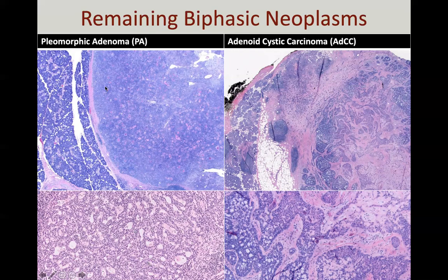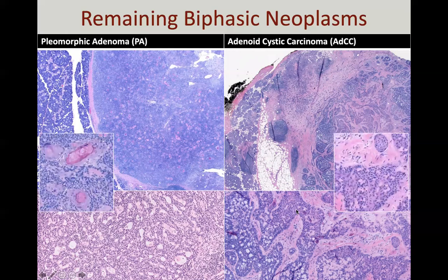And really only on resection are you able to tell that the tumor on the left is completely circumscribed and would otherwise represent a pleomorphic adenoma. There's maybe a little bit of chondroid stroma right here, and the tumor on the right being definitively infiltrative and definitely being an invasive carcinoma. So sometimes it's not until resection that you're able to definitively differentiate between these types of neoplasms.